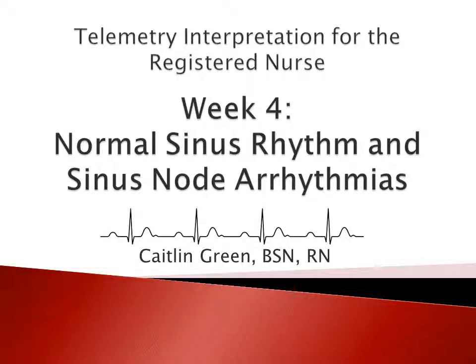Hi everyone, this is Caitlin Green, and I'm going to be presenting what would be week 4 of a telemetry interpretation for the registered nurse class. And this week's topic will be normal sinus rhythm and sinus node arrhythmias.